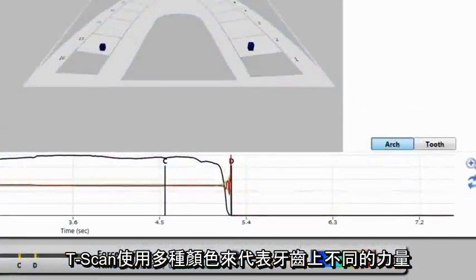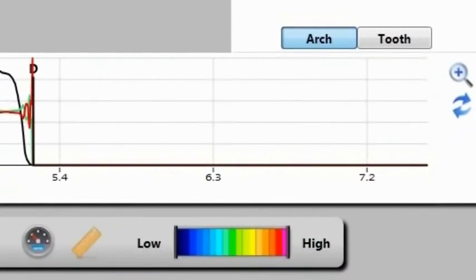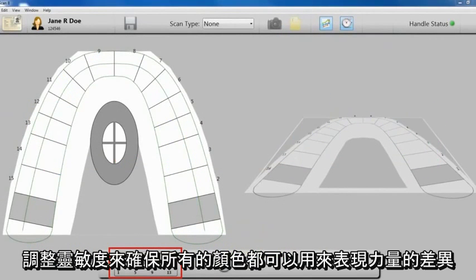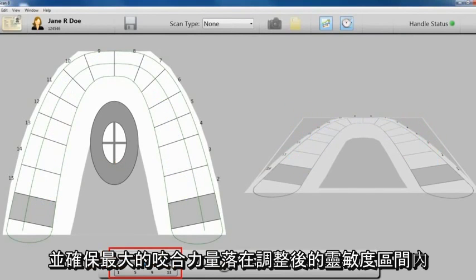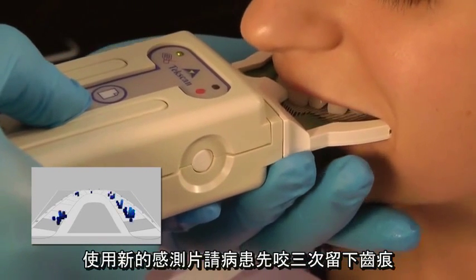T-Scan uses a range of colors to differentiate the forces on the teeth. Adjusting sensitivity ensures that the entire color spectrum is used to visualize the differences in these forces, and that the maximum forces are within the sensor's force range. Ask your patient to bite and clench firmly.